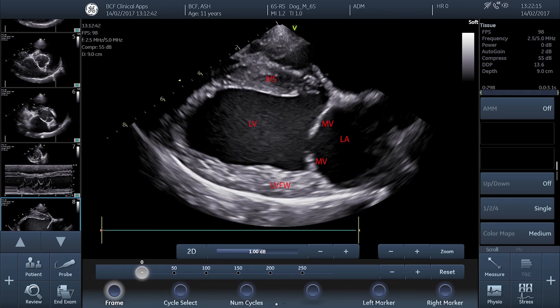Looking at this view here, we've tried to make the long axis of the heart as horizontal on the screen as possible. We've also tried to ensure that we've got a continuous view of the interventricular septum from the left of the screen across to where it meets the interatrial septum, and we've deliberately tried to avoid showing any of the left ventricular outflow tract in the image.